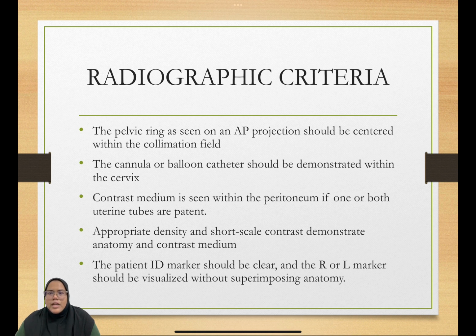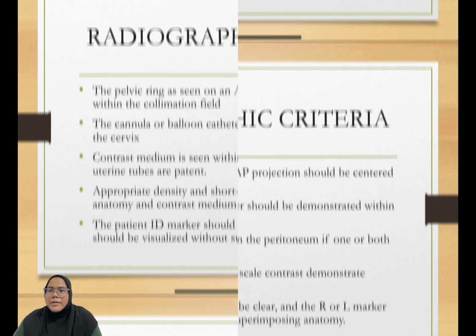Appropriate density and short scale contrast demonstrate the anatomy and contrast medium. The patient ID marker should be clear, and the right or left marker should be visualized without superimposing the anatomy.